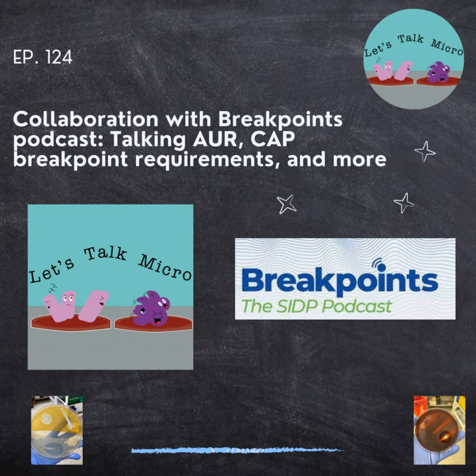It even starts at the beginning with the first part that we talked about, which was finding what your breakpoint is. So there's a spreadsheet where you can say, okay, where's the information? Do I have it in the LIS? Do I have it in the health record? What instruments am I using? It has all the sections. What year are the breakpoints? When were they revised? So it's a great step to start gathering all that information.